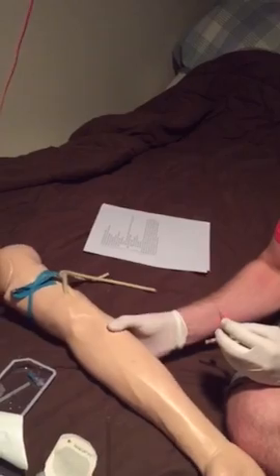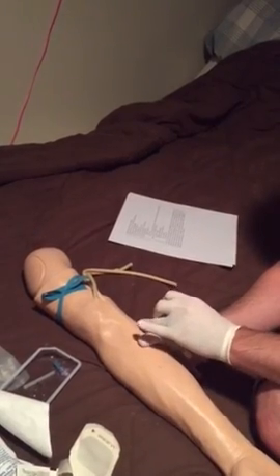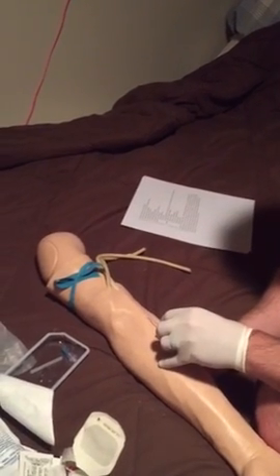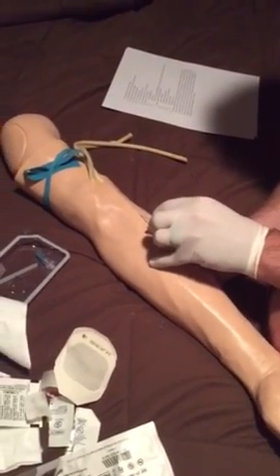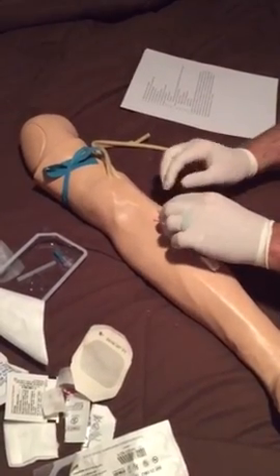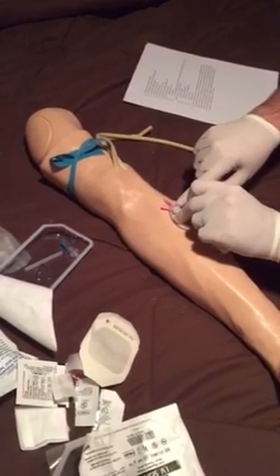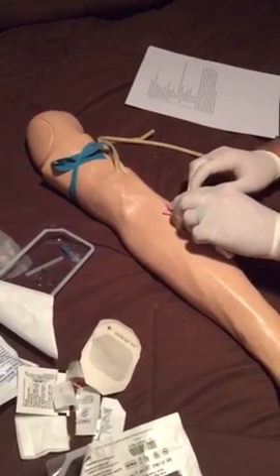So we've cleansed our site. Grab beneath the elbow. And then what I like to do is I like to choose visually where I want to go and start the needle just below that. So at an angle, we're going to perform the puncture. Now normally, if you were using a straight catheter, so we'd get our flash in here, just in the center of the butterfly, just a little bit of blood flashing in there.